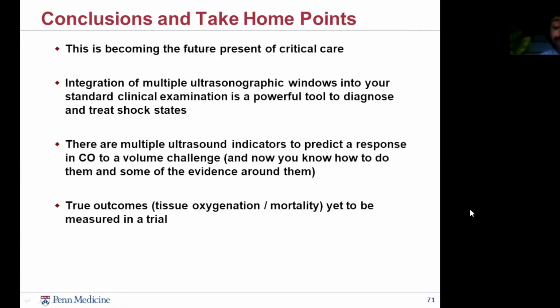At first I was very excited about carotid Doppler. The problem is that in addition to carotid flow changing during passive leg raise or during the respiratory cycle, the diameter of the carotid changes as well. And this is what was demonstrated by the group who did the study on cardiac surgery patients.